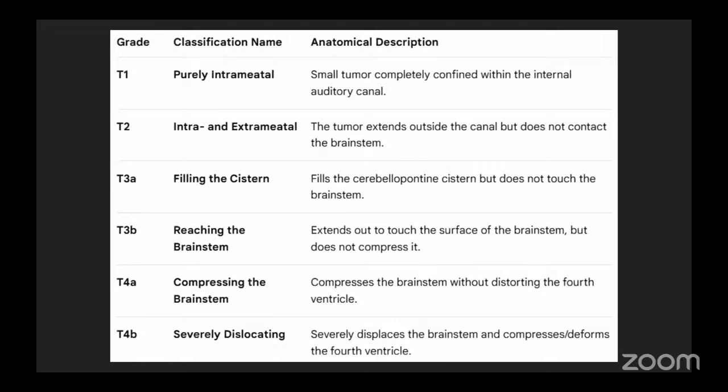We did the Hanover grading, which told us about the size and the classification of the vestibular schwannoma in terms of the structures it is affecting. Today, we are going to cover the Koos grading. And then, as I said, we are going to spend a substantial amount of time on the investigations, especially the PTA, because that is a sore point for a lot of residents. Let's start from Hanover grading so that we have something to connect back to. We did these yesterday, right?